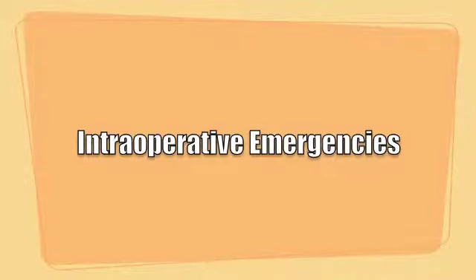Deterioration in a patient's respiratory status can happen at any time while you provide anesthesia. In this video, we are going to show you the management of two different respiratory-related intraoperative emergencies.